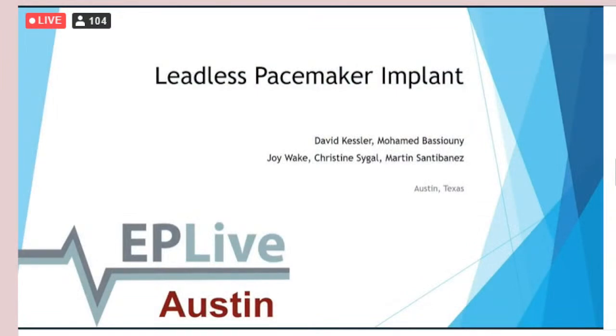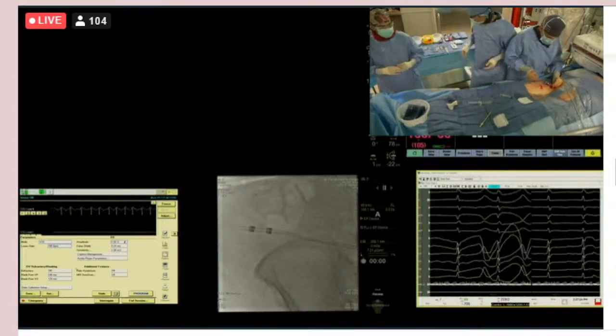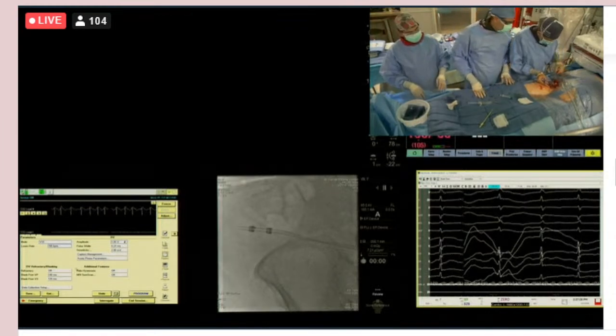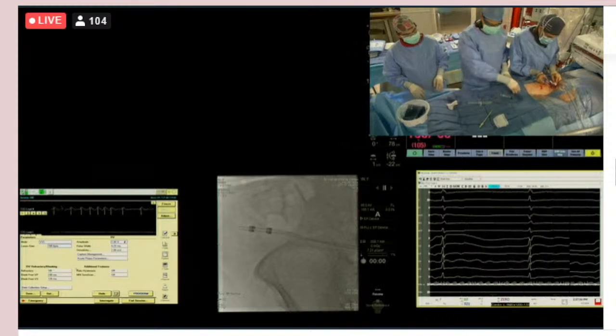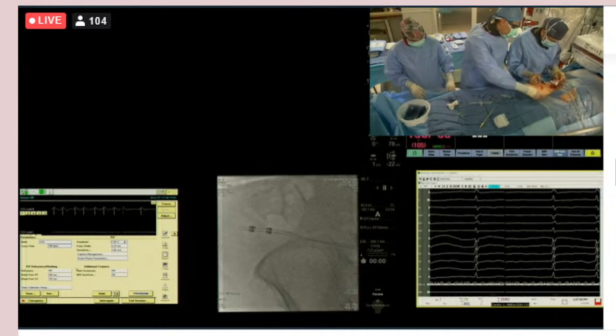Okay, David and Mohammed, can you hear us? Yeah. Okay, do you want to give us an introduction, tell us what's going on? Yeah, one sec. We're just getting the perclose set up, the pre-closes. One second, okay?